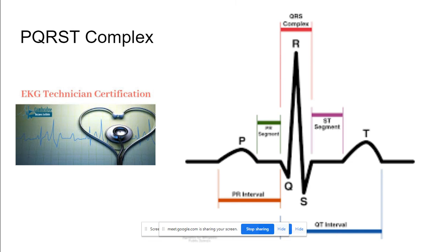I believe that you can, but I would just be careful because I don't know if they've enlarged it. And so you can still use your calipers to help count, but you wouldn't want to use it to measure because they might not be set up with each small box at 1 millimeter. Okay. You know what I mean?